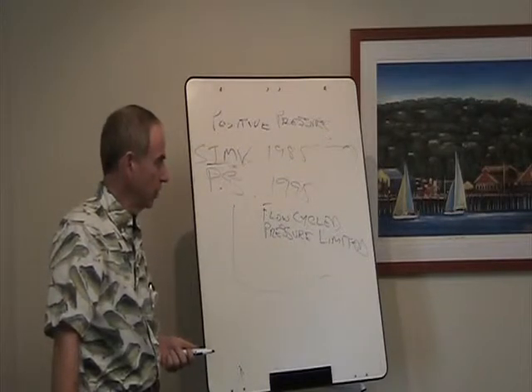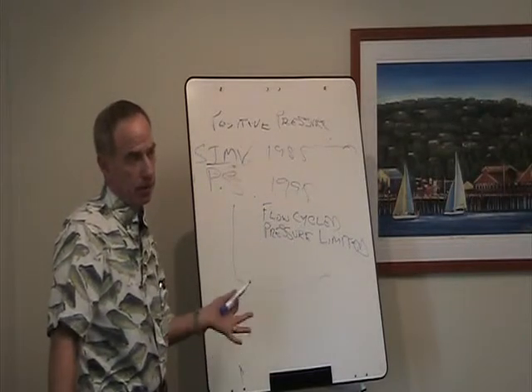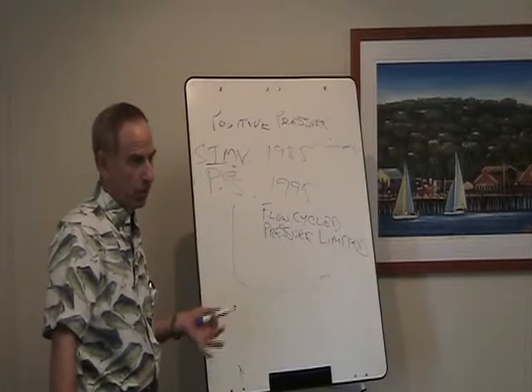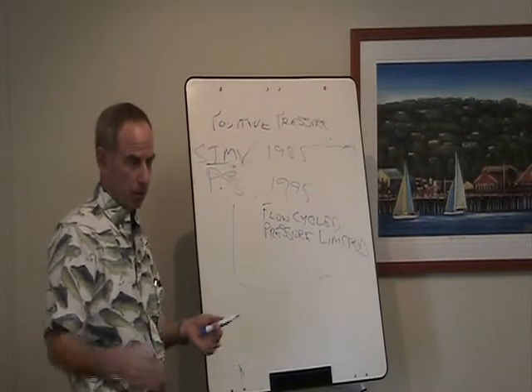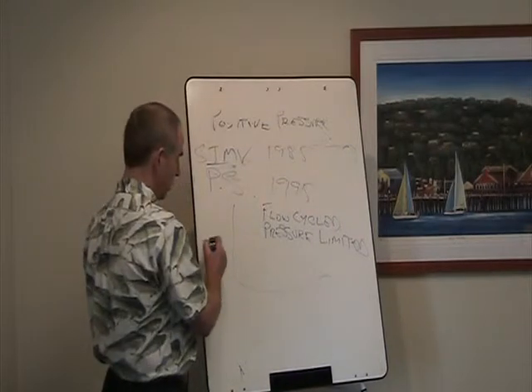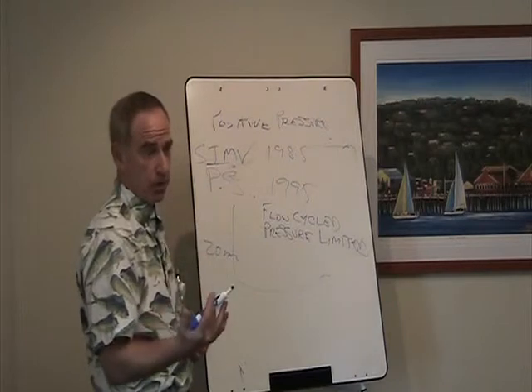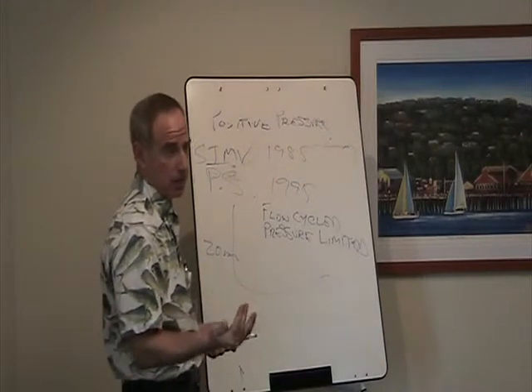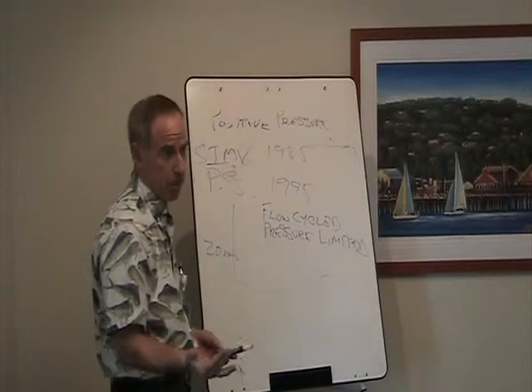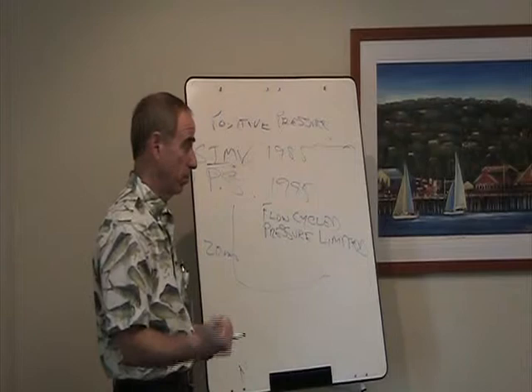So when we say it's pressure limited, that means we dial in the pressure. It's a pressure mode of ventilation. It's not a volume mode. You're not giving them a volume, right? You're ordering a pressure, okay? So say you order 20 centimeters of pressure. It's going to give them 20 centimeters of pressure when they take a spontaneous breath and trigger it, okay? So it's triggered by the patient's breath.